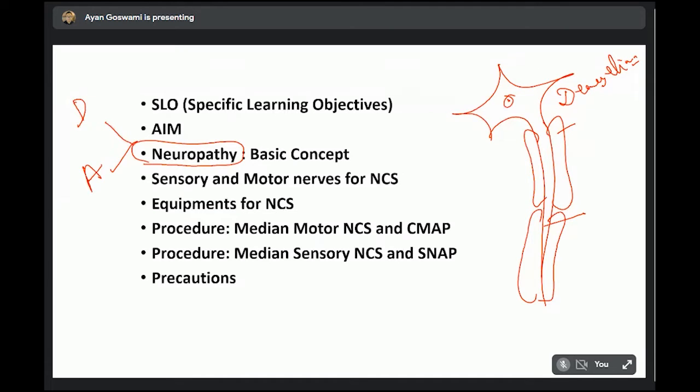So to perform this study, it is an investigation. Very commonly, you will see that in case of a diabetic patient, doctors prescribe a nerve conduction study. With this nerve conduction study, we can determine whether the patient is suffering from any demyelination disease or axonal disease, and very frequently the patient may be suffering from both varieties, that means mixed neuropathy, demyelination and axonal neuropathy, right?